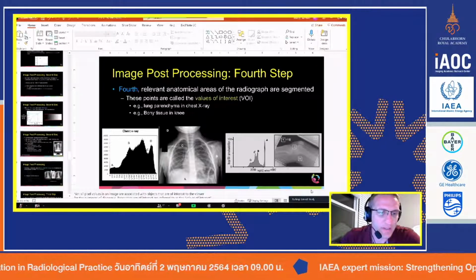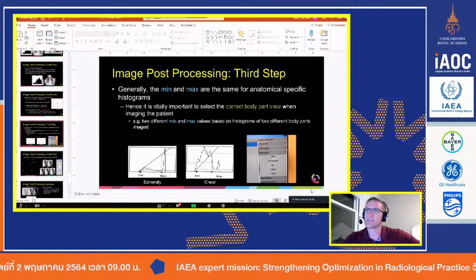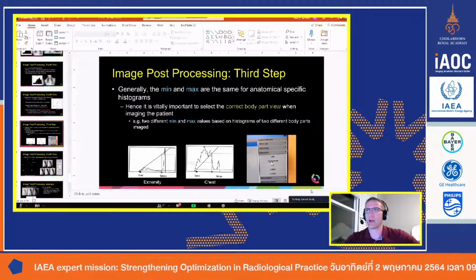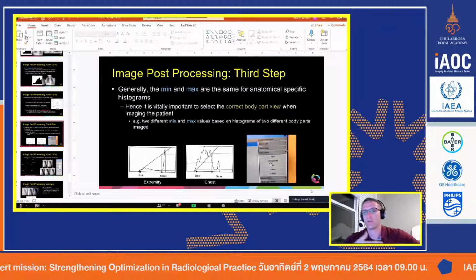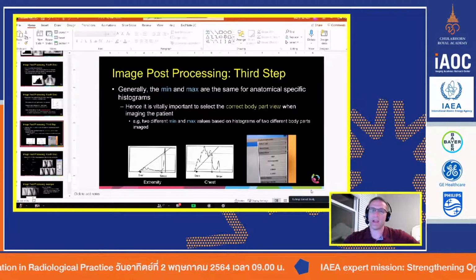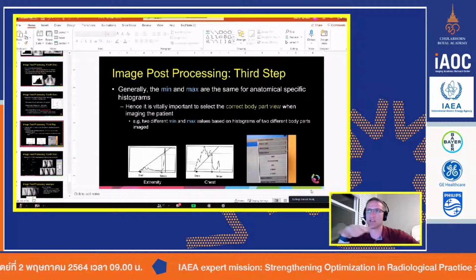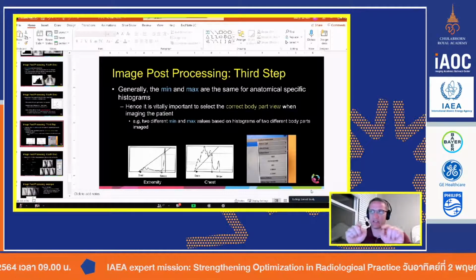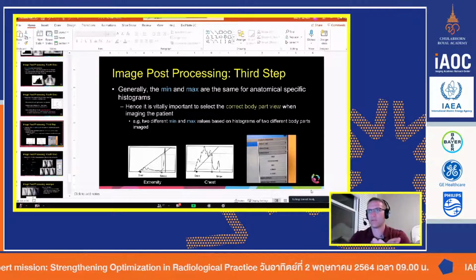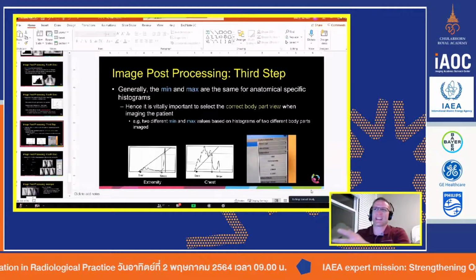They will have different options right here. So you will have maybe a kid's chest versus an adult chest. Part of that is because a kid's chest will not have the potential for breast anatomy, whereas an adult chest will have that potential. So there may be slight differences. If your system has chest for pediatrics or chest for kids and chest for adults, make sure you make those two distinctions. Basically from adolescence on, from teenagers on, you should probably just pick the adult, because teenagers are just kind of small adults.